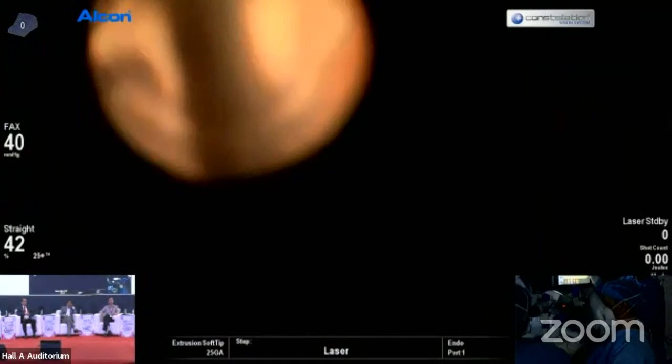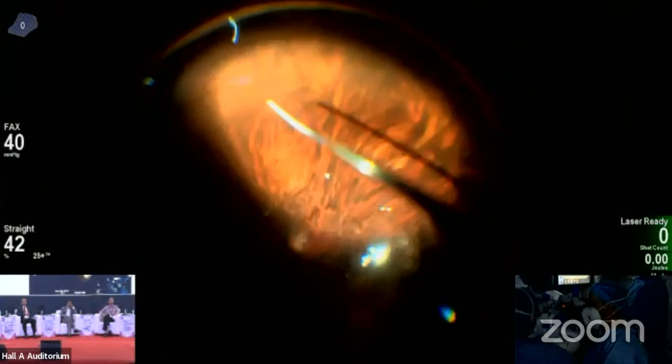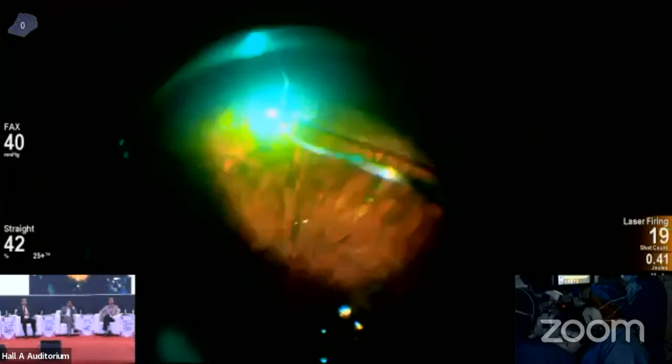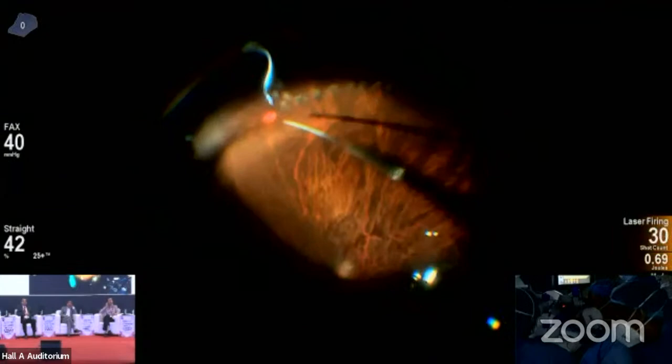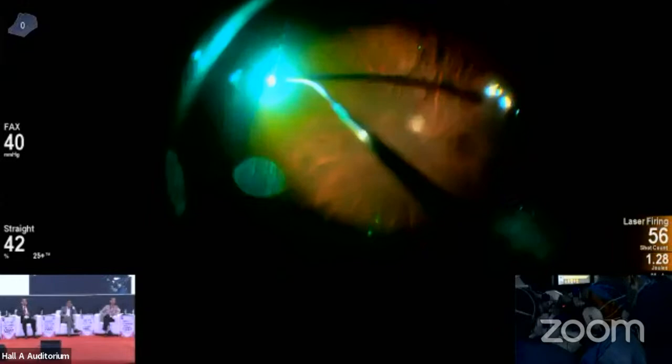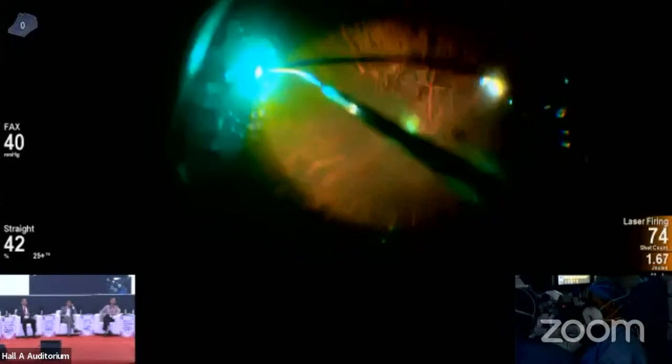So in most of these cases, I prefer to do 360 degree laser photocoagulation. So we'll start from the inferior periphery. So here, fortunately, the break is just short of a GRT. That is why Dr. Vinod has nicely managed it the way he did it. But had it been a full GRT with a folded flap, then the drainage technique would have been different. I think Dr. Vinod can elaborate on that.